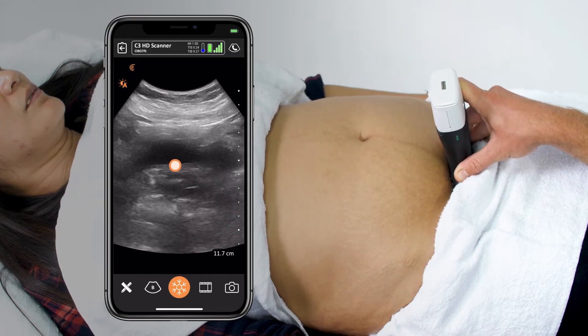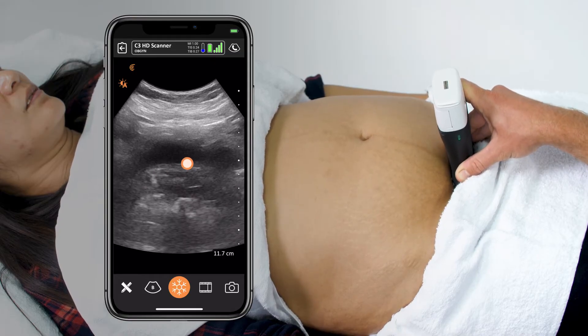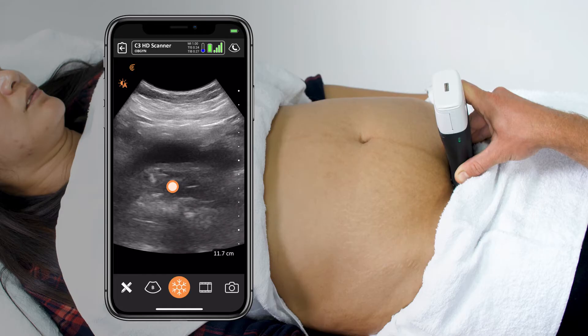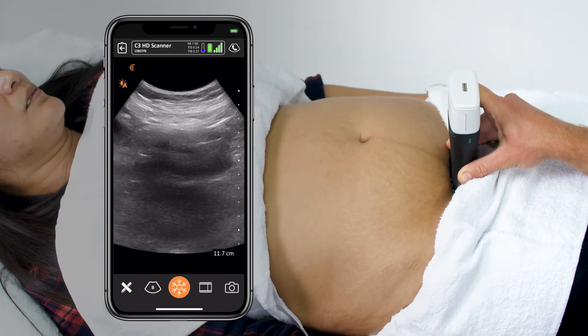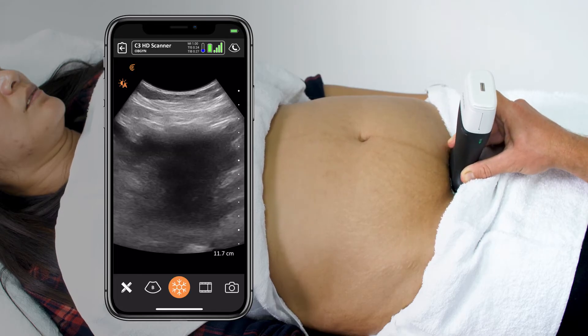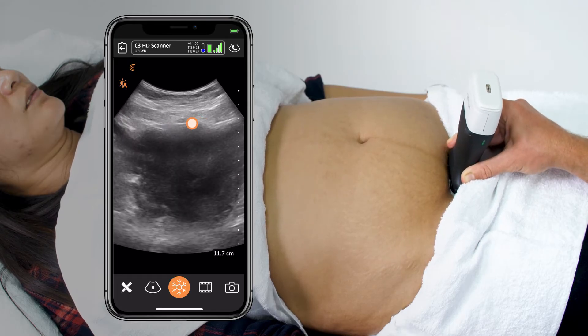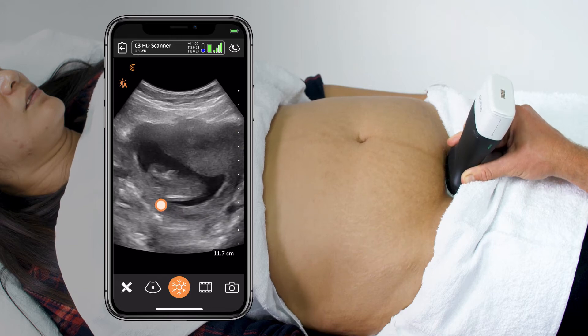Once I've confidently identified the bladder above the vaginal stripe, I'll take the top of the transducer and start tilting it towards the feet until the uterus comes into view, and ideally a fetus within it.